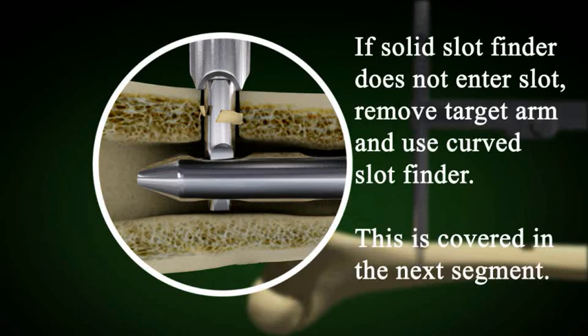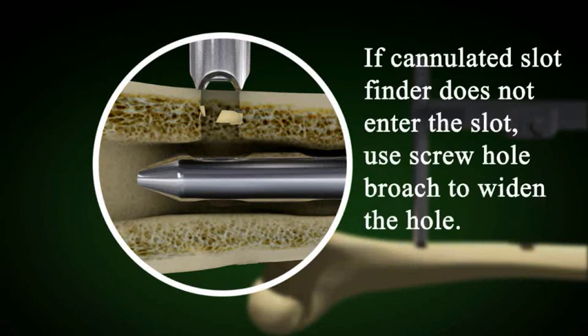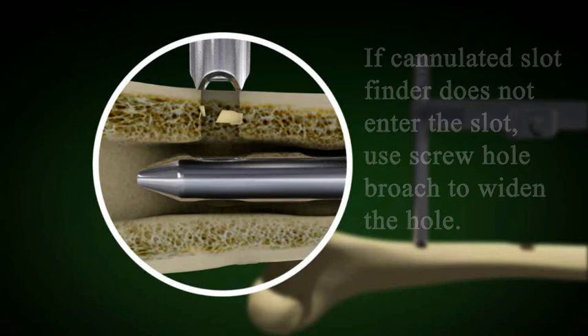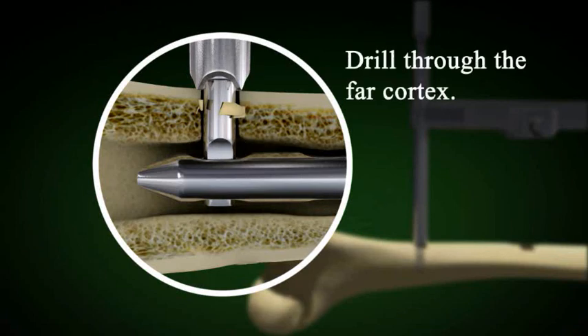If the solid slot finder does not enter the slot, don't keep poking around. Remove the target arm and use the curved slot finder. Note that the cannulated slot finder may not go through the hole even though the solid slot finder does, because the cannulated slot finder has a wider diameter. Use the screw hole broach again if needed.